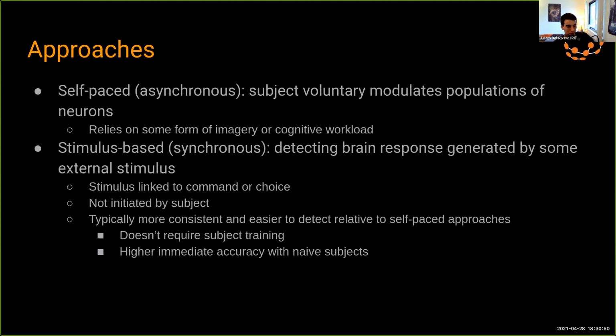Cool. Yeah, so I don't know if I've tried EEG Lab, but I do use MNE Python for analysis after having collected some data. I think it's really a great open source tool. It's definitely something you should know about if you're interested in this area. What I use for my real-time, if you will, BCI system is a package called BrainFlow, and this allows you to pick up information from various boards. It's board agnostic, so you can pick up EEG data from all different kinds of boards. In my case, the OpenBCI Cyton board, and it also has some signal processing tools built in. So that's what I use for real time.